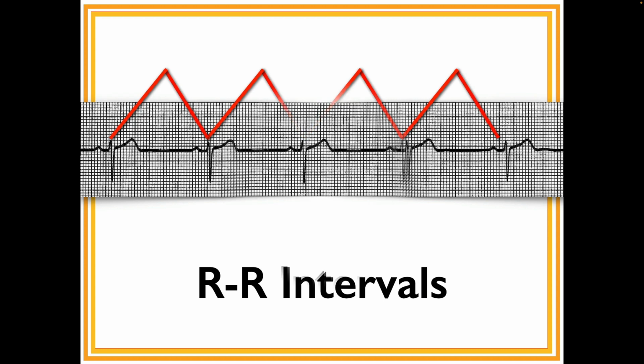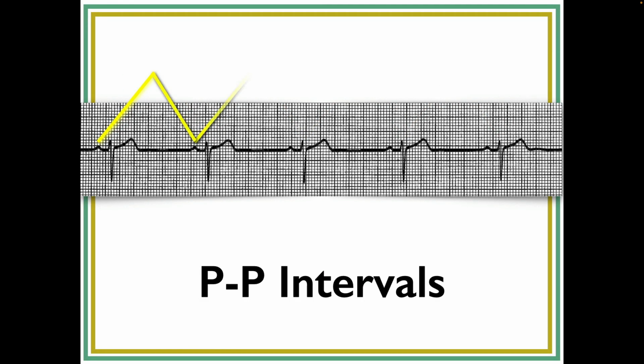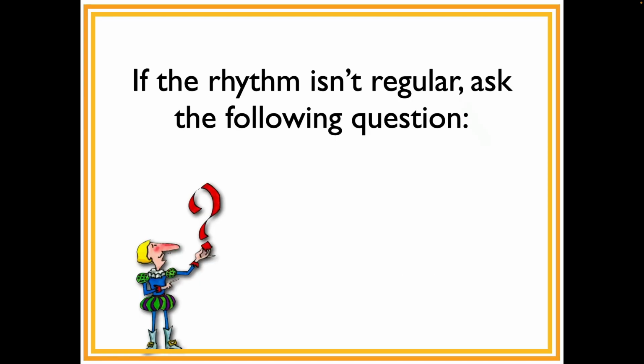Then the second part of this, which again won't make any sense right away, is you do the same with the P waves. Do the P waves march out? And when we say, do they march out, what we're really saying is, do they march out regularly? Now, that's easy, yes or no.